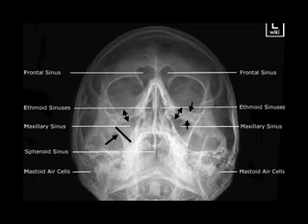Medial wall of the maxillary antrum. The medial wall of the maxillary antrum is a long plate 5 centimeters in length and when viewed end-on presents as an indistinct shadow. When there is erosion of the medial wall on one side, this side appears less distinct than the other. This is suggestive of an erosion of the medial wall in a maxillary antrum tumor.